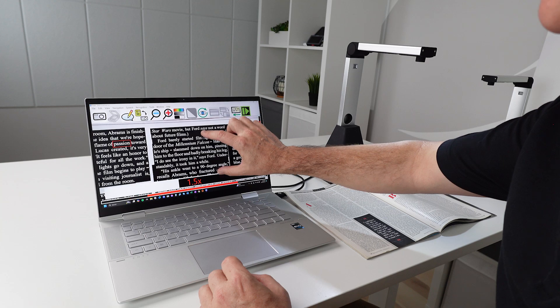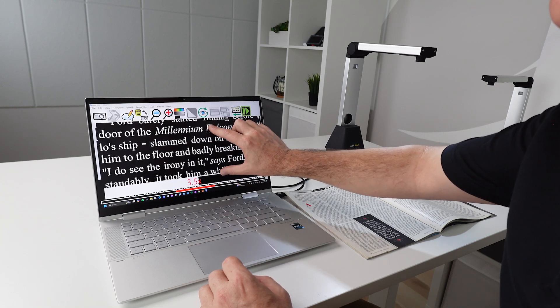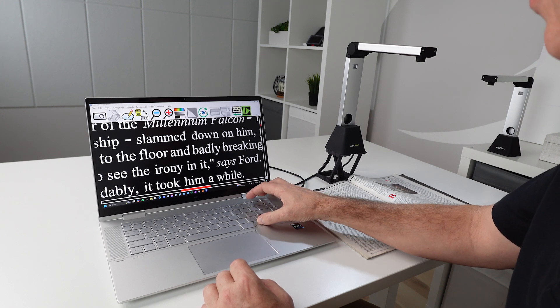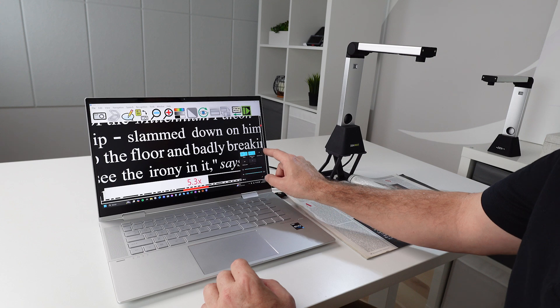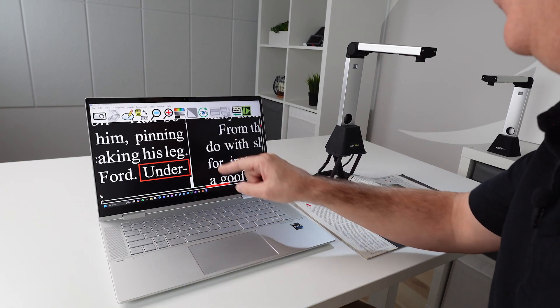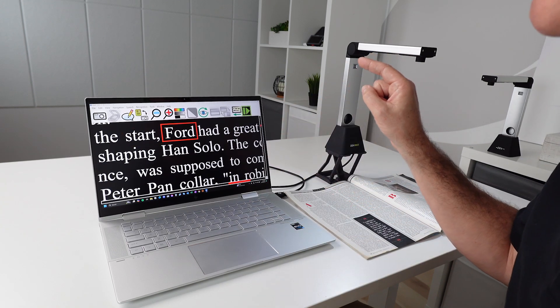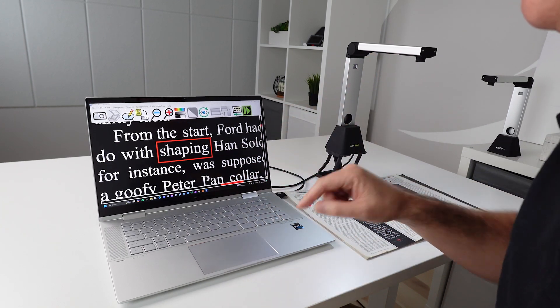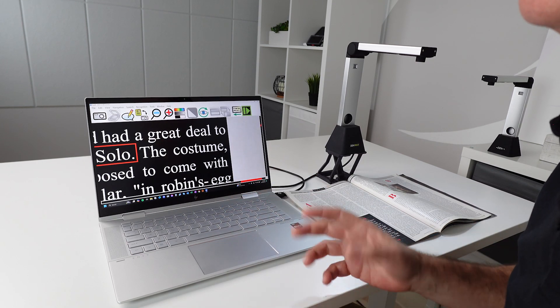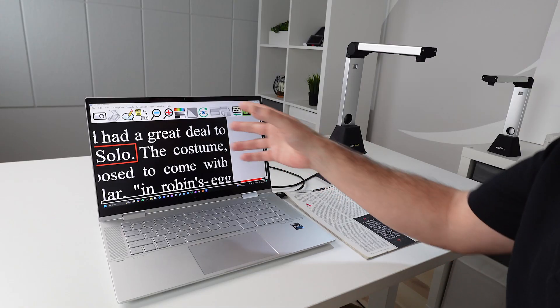I've got touch screen ability here, so I can zoom in, and I can also use Control plus or minus. There are also screen icons. If you touch on a word, it will start reading from that point. Press on it again and it'll stop. You can also use the Enter button to start and stop. Lots of different ways to do this — mouse, touch screen, screen icons. There are many different ways you can use this device.